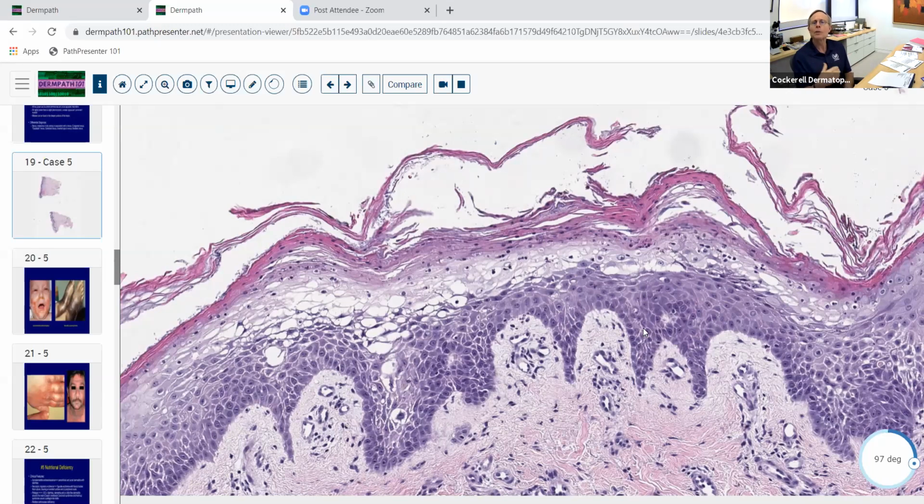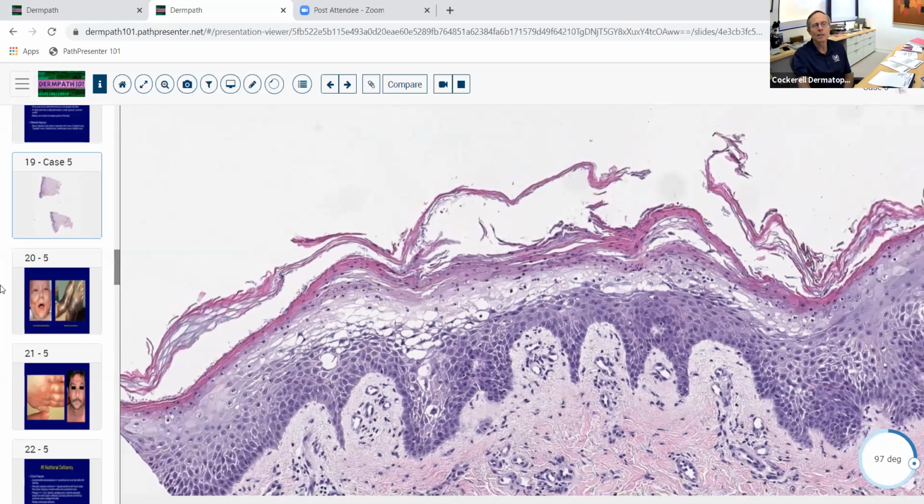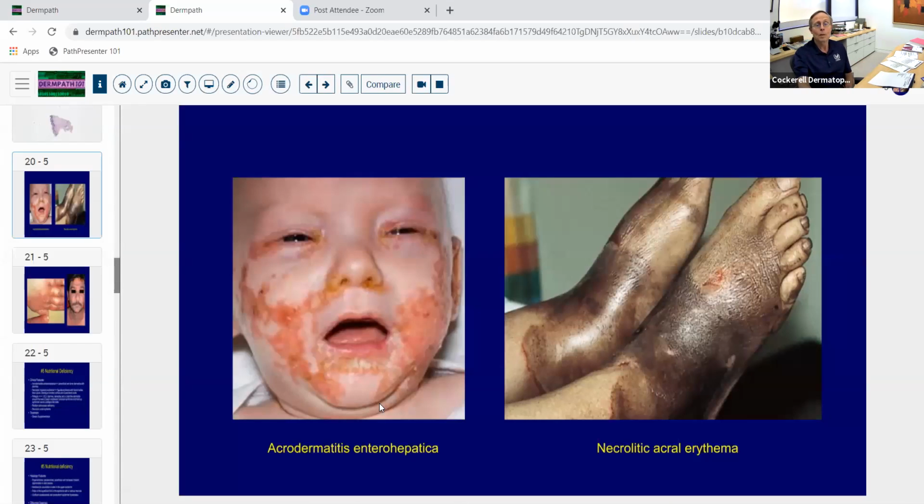And then sometimes irritant reactions, outside in, somebody that's a mechanic and maybe they got gasoline on their hands or something like that. But that's not usually going to give you this nice, beautiful ballooning degeneration that stops right there. That's going to usually involve the entire thickness of the epidermis. And it doesn't give you this sort of nice zone of parakeratosis up here like you see here. So this is really almost pathognomonic of a deficiency disease. And they all look the same. On the microscope, they pretty much all look the same.